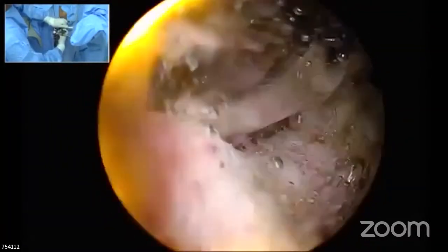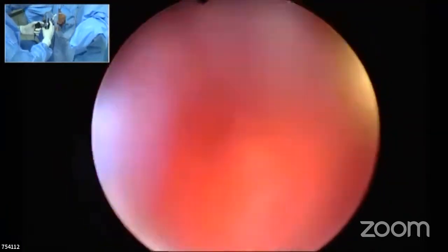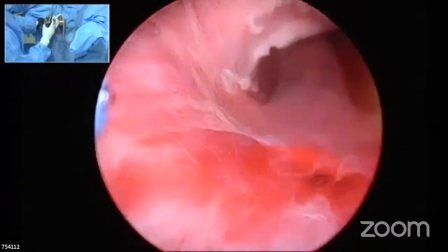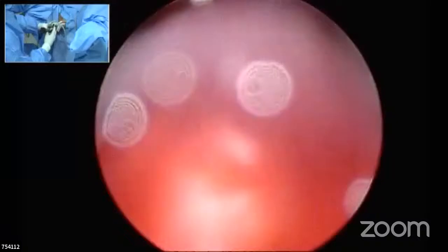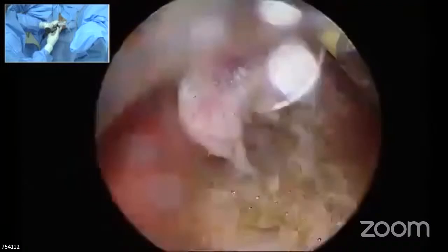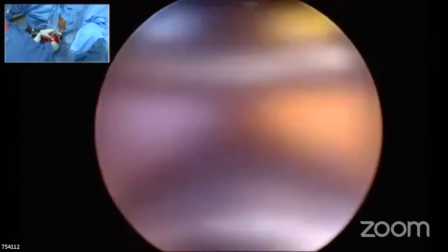You see, I don't think that there is a big change in the concept, the way you do it, whether you have a lobe which is extending up to this point, up to this point or up to this point. The concept is going to be the same. You are going to leave that tissue which is attached to the mucosa and that muscular and the muscle below, and take out the gland part which is inside that. That is the only concept. So for that, I'll show you again with the resection at the apex. I'm going to show that.